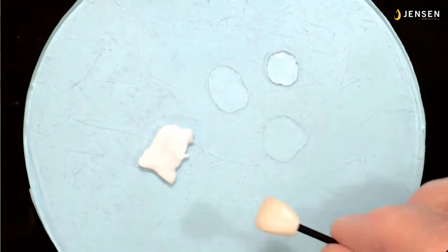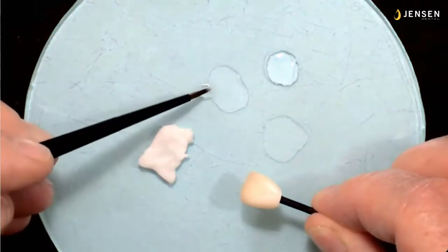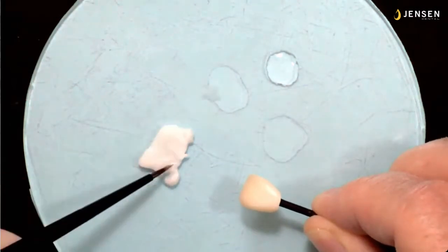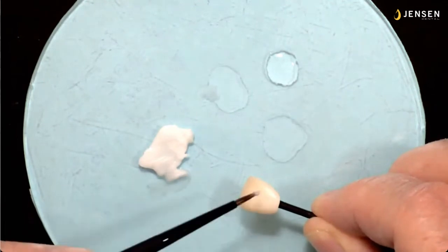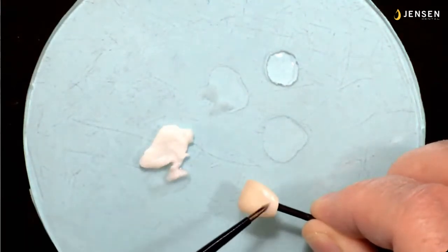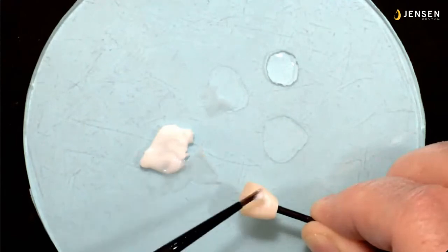And this will be like building porcelain, but this material has a lot of the liquid in it, so it's very tacky, very gummy. So you're going to have to dilute it down a lot. And some people like to do it with a brush. I find if I do the majority of it with the tiling type effect, like I showed you with a spatula, and I just fill in the areas I need for contour, it's faster for me to do it that way. But some people will want to loosen this up with a little bit of water on their glass slab, and then they can build it like they're building porcelain.